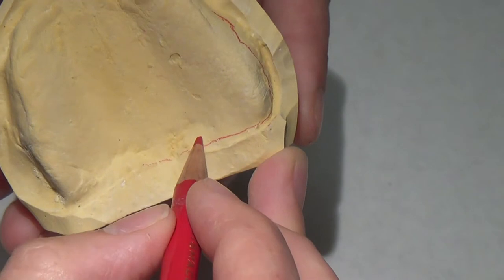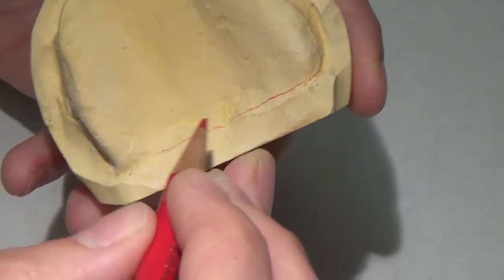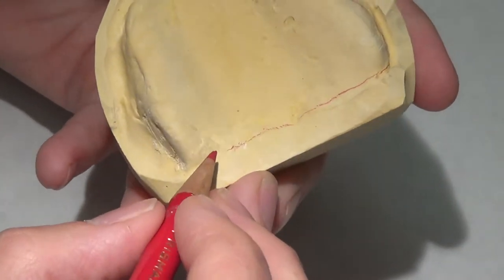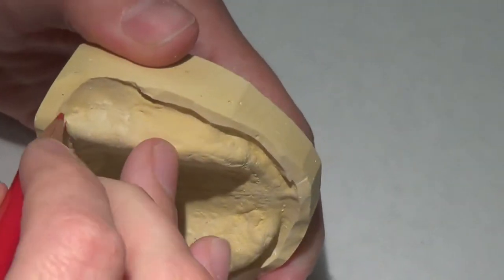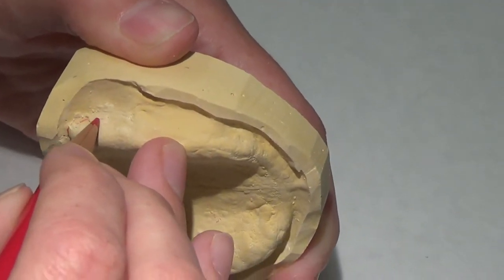She has some kind of funny anatomy right here. So because I'm not sure at this point, I'm going to extend my tray all the way back to it. Come short.